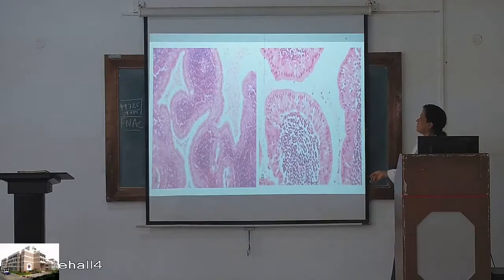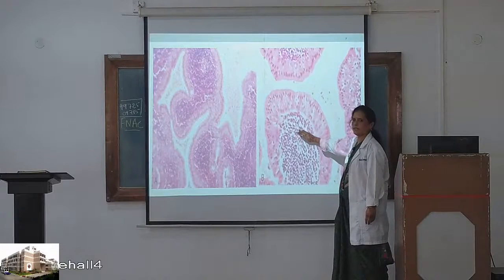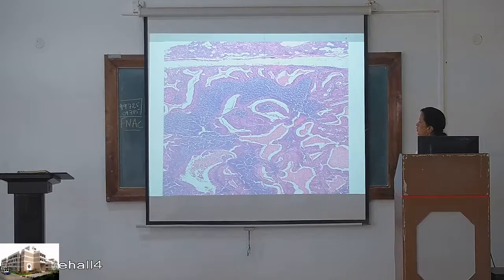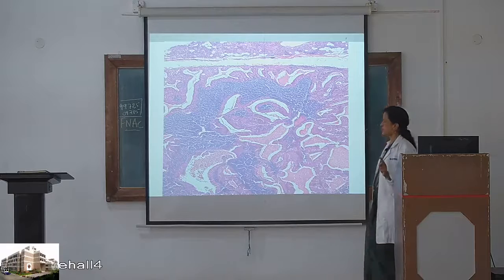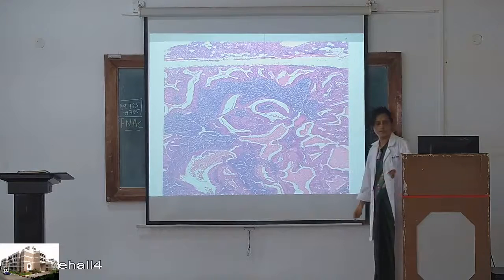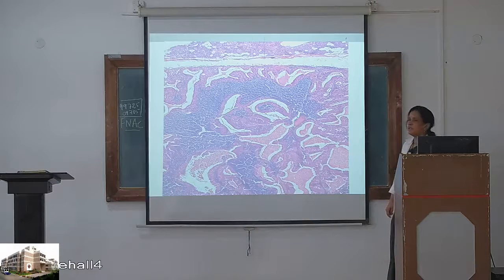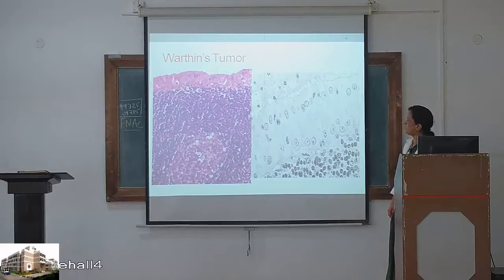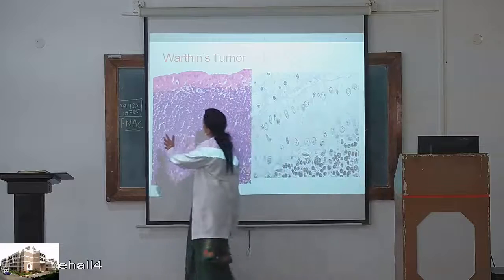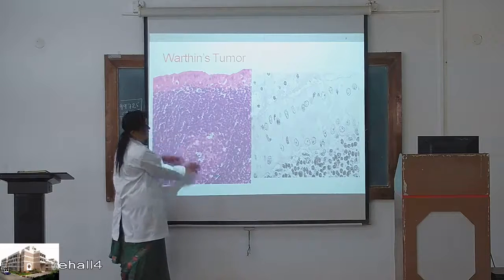This is the same picture which you saw previously. So the columnar cells within and then cuboidal cells towards the lymphoid tissue. And in the pictures which show germinal center, there are a lot of cystic spaces. All these are cystic spaces which have got that viscous, eosinophilic material. Now two colors you can make out very well. Pink is epithelium, the rest of it is lymphoid tissue. See, the lining cells are so well made out here. This is the rich lymphoid tissue. That's why they asked, where did it arise from? Probably the epithelial component has got stuck in the lymph node.